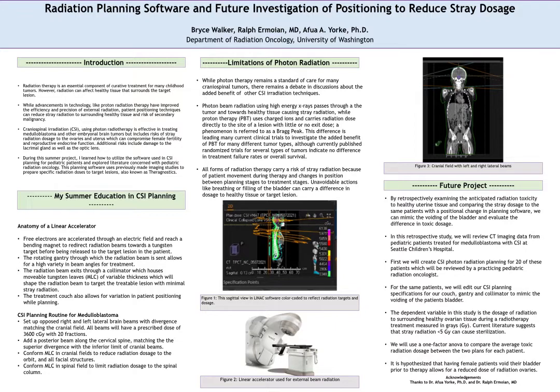So this all helps target our dose to the lesion that we're trying to irradiate, but with photon radiation, the beam will always pass through the target lesion and into anatomical structures beyond that lesion. So this concept is especially important when we're talking about craniospinal irradiation, because when we're talking about radiating the brain and the spine, you could understand that a number of important structures might receive a dose of radiation that can be detrimental to the function of that tissue.